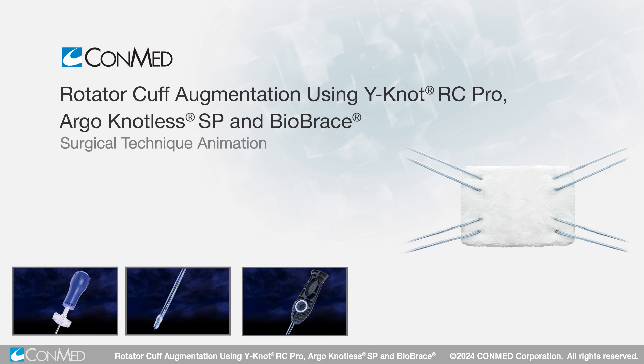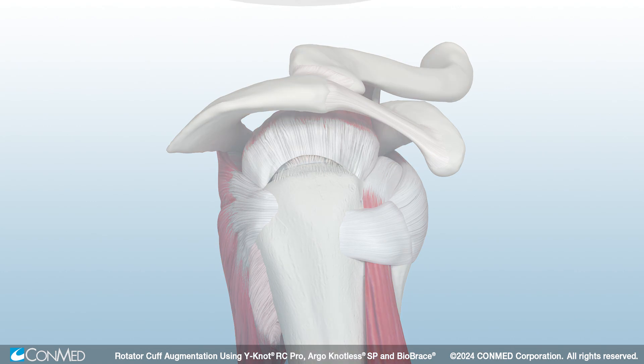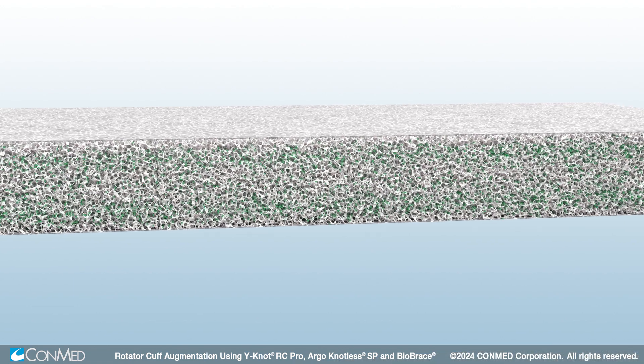This animation features an all-self-punching technique for an efficient, streamlined rotator cuff augmentation. The Biobrace Implant is a novel augment designed to strengthen repairs and optimize healing.